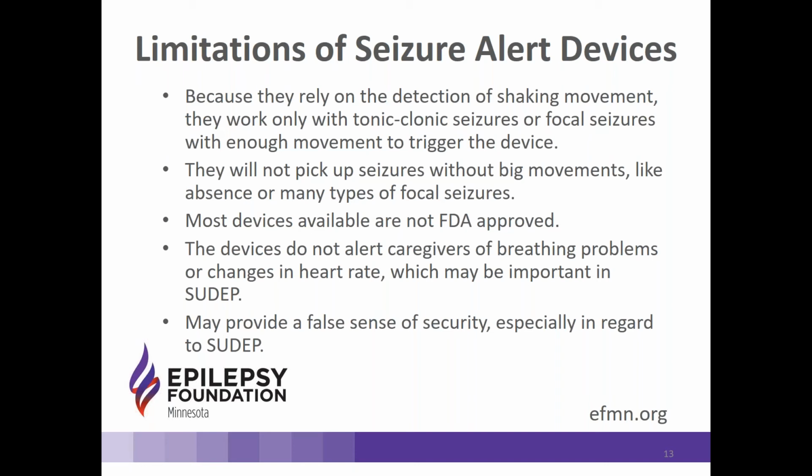One of the big limitations of these devices, and again, there are many reasons that these are helpful for people, but one thing to be aware of is that you want to make sure that getting a seizure alert device doesn't provide you with some false sense of security, especially in regard to SUDEP. The worst possible thing would be for someone to think, oh, well, now I have this device and I don't have to worry about taking my medicine on time or avoiding seizure triggers or eating well or getting enough sleep, all of the things that they should be doing to protect themselves. Devices are not a cure-all. They're just another tool in the toolbox. Managing epilepsy in other ways is still very important.